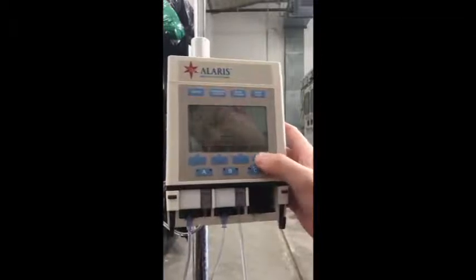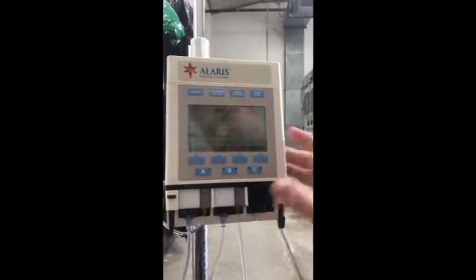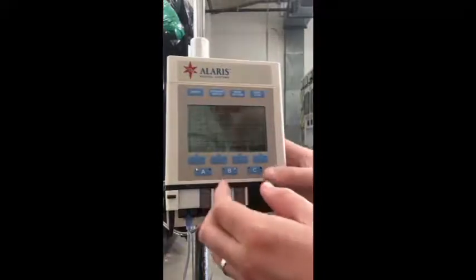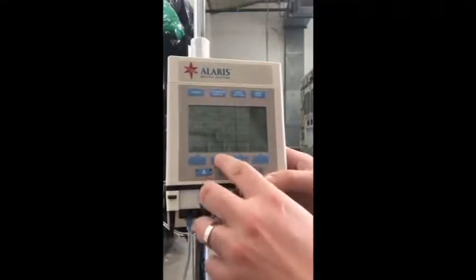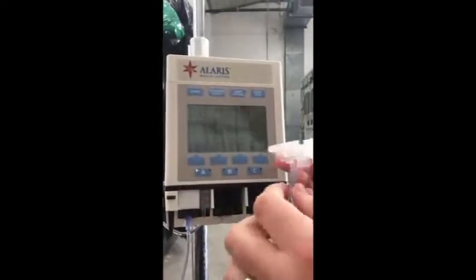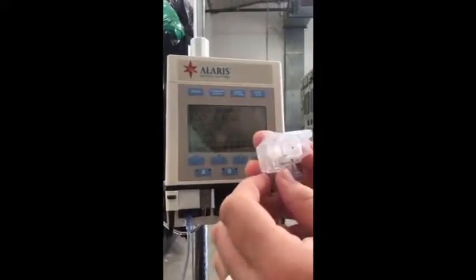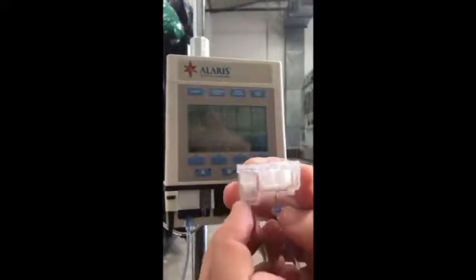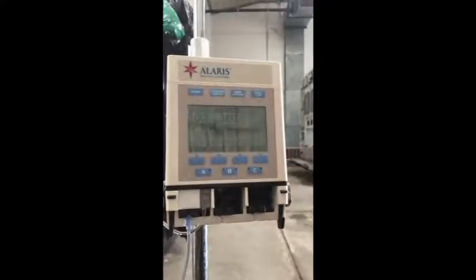There we have an alarm. Hit the quiet button first. Cassette jammed, cleared channel obstruction, or replace damaged cassette, and press start to resume. And so a lot of times when you get this, you'll let it cancel. And what I will do is take it out and then examine it, make sure I don't see any damages. And here you see that this used one that I've been using is a little bit crooked and bent.